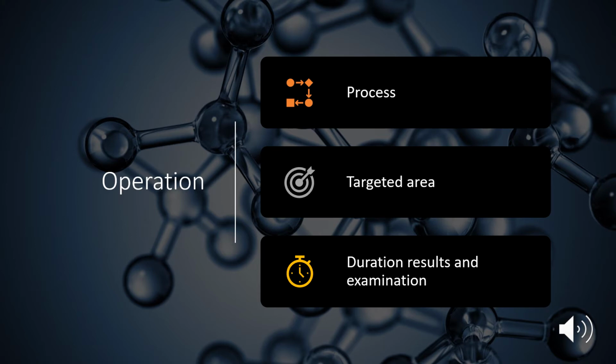There are many options in the CT scan device that can be applied in terms of combining those results. Pictures can be displayed in two-dimensional or separate form, or all pictures can be connected or stuck together to generate a three-dimensional structure. The three-dimensional structure helps the monitoring of the treatment.